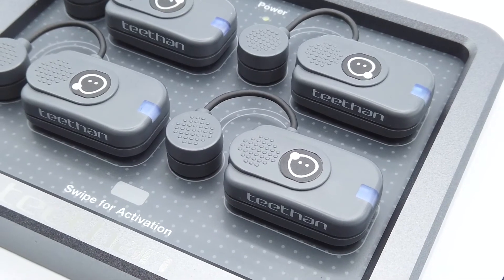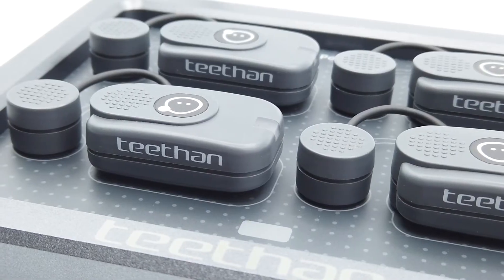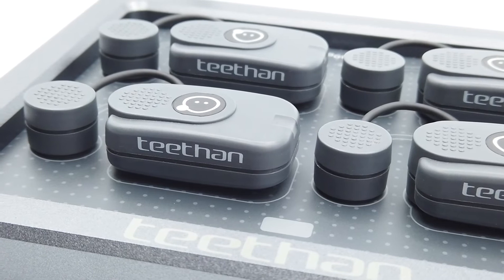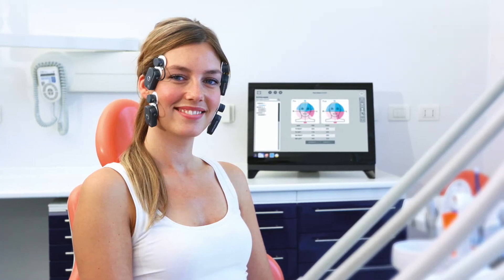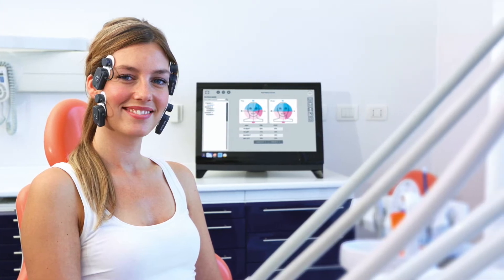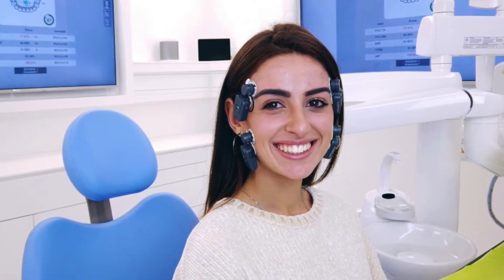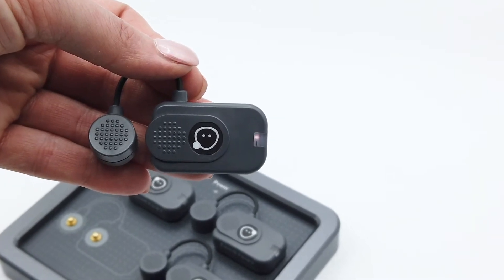T-VAN provides an extensive range of clinical benefits that enable your practice to improve and validate your treatment, increase revenue and remain at the forefront of dental healthcare innovation. Whether you are dealing with TMJ pain, TMD, bruxism, splint evaluations, implants, full arch restorations, occlusal vertical dimension, trauma, prosthetic or orthodontic treatment, T-VAN is a digital assistant always by your side.